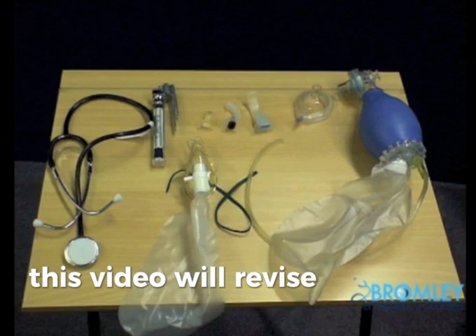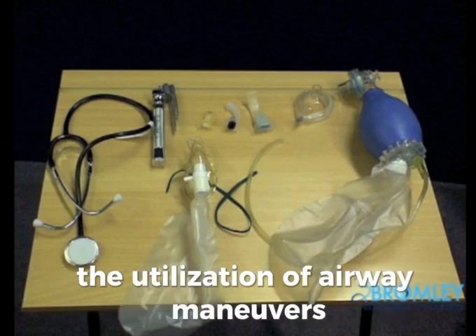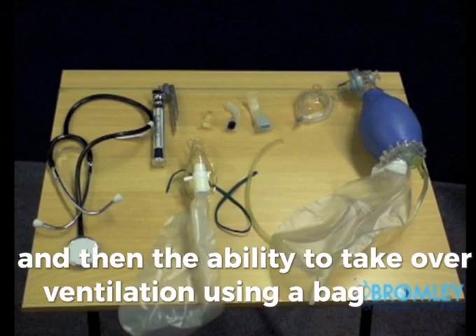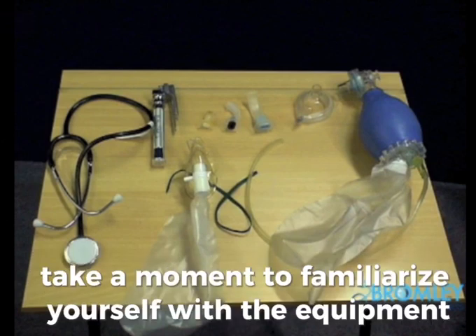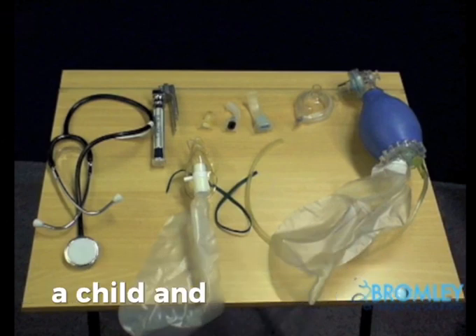This video will revise the initial assessment of an airway, the utilization of airway maneuvers, the utilization of airway adjuncts, and then the ability to take over ventilation using a bag valve mask until a definitive airway can be achieved. Take a moment to familiarize yourself with the equipment and to think about the anatomical differences between an infant, a child, and the adult airway.